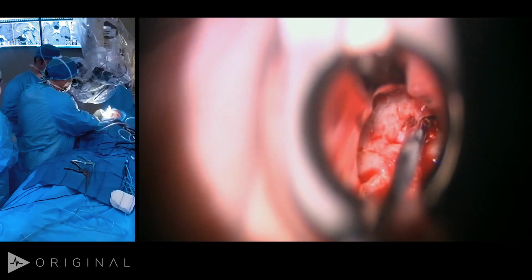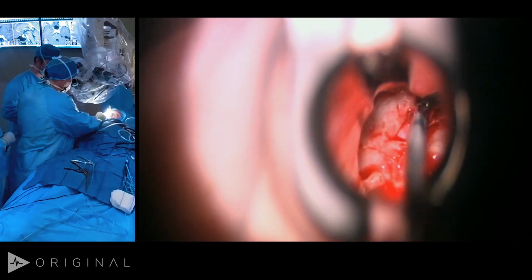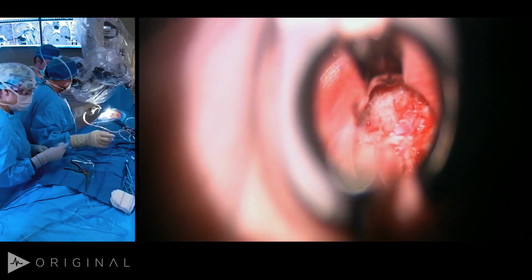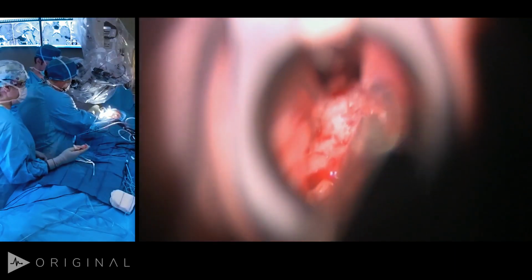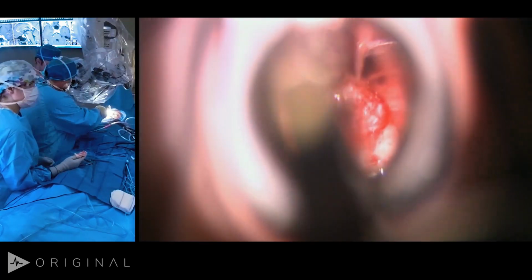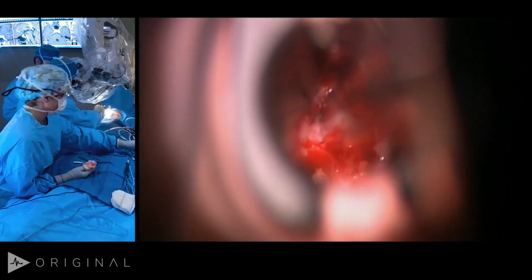There we go. In Cushing's patients, it's common to find a large circular sinus. In fact, we can see some discoloration there. Could I have the small angled Kerrison now? I think it's very helpful to get a broad exposure, especially for microadenomas, which tend to be lateral. But you don't want to be dangerous. You always want to be mindful where the carotids are. Now we know that her tumor, we think on MRI, is on her right. So we want to make sure in particular that we have good exposure there.